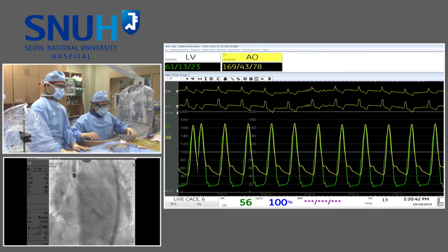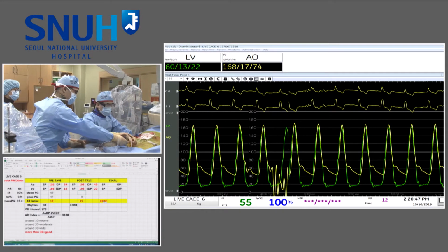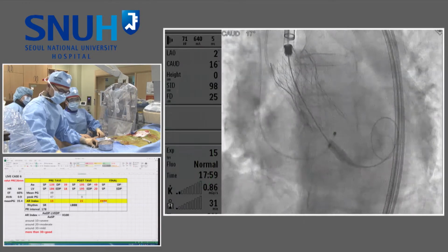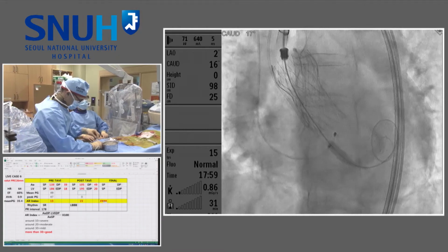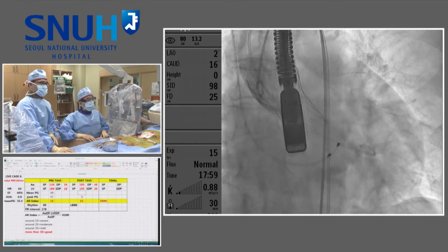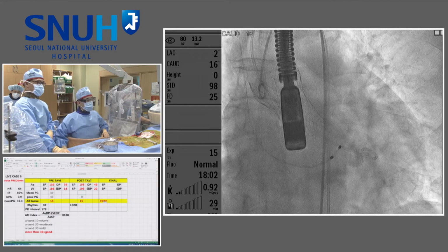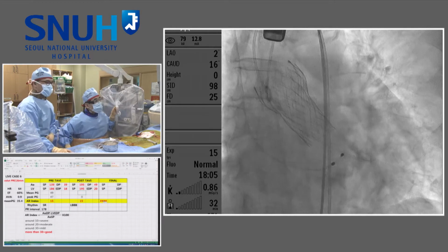I think this is extremely important, what was just said. We call it, in very simple words, the memory of the AI index. A patient that starts the procedure with a hemodynamic that looks like this, because of non-compliance, because of AI before the procedure, is not going to change pretty much immediately after the procedure, and you should not expect it to. That's exactly what he just said.